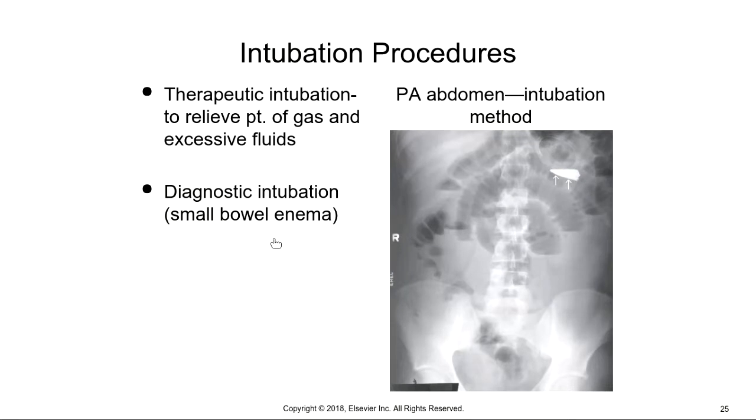So the diagnostic intubation is similar to the enteroclysis, except that you're not using two different contrasts. It's just the one. And instead of them drinking the barium, you're intubating the patient and then forcing that barium through the tube. Okay, so diagnostic intubation is called a small bowel enema. And in a therapeutic intubation, you're not trying to diagnose anything, you're trying to relieve something from the patient themselves.